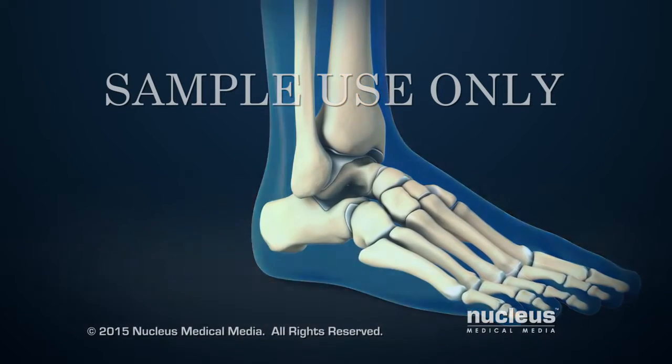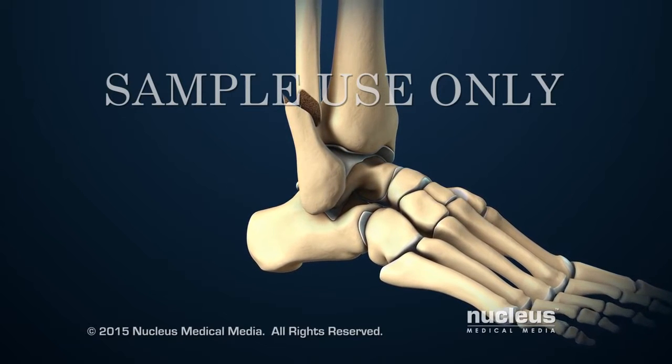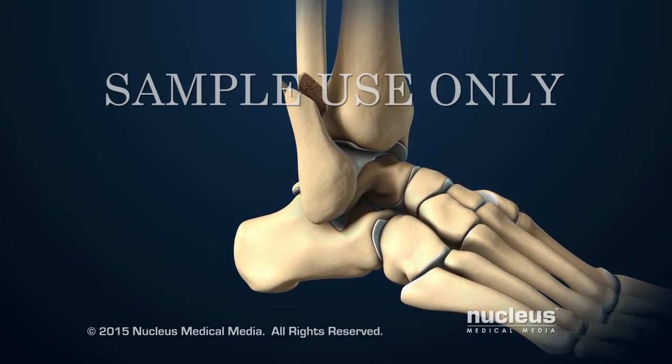If a person breaks their ankle and the bones no longer line up with each other, a doctor may need to perform a surgical procedure to reposition and secure the bones.